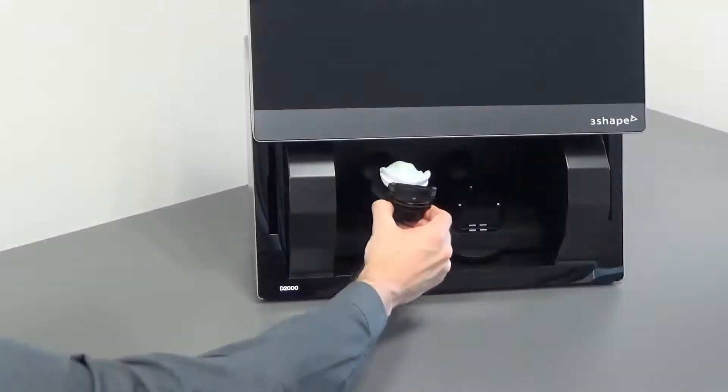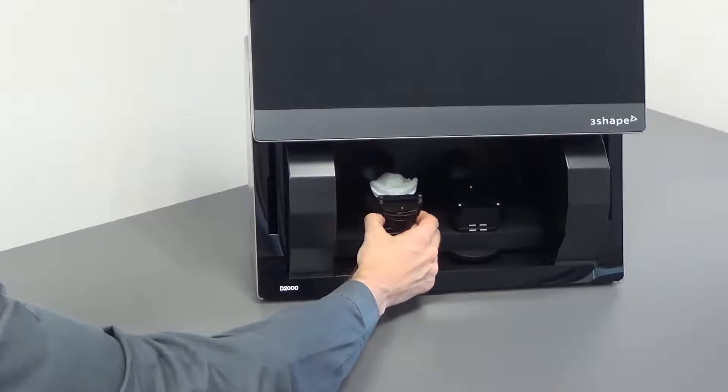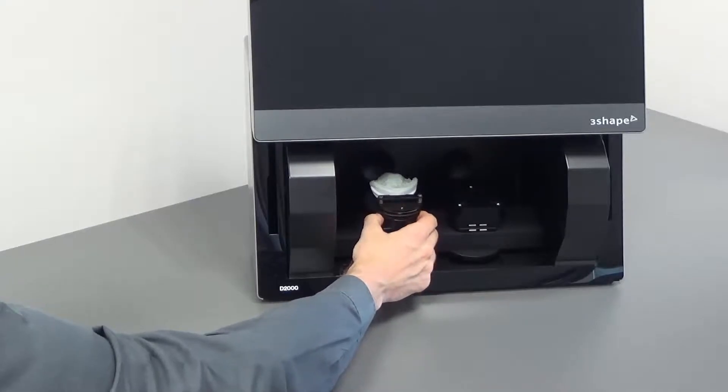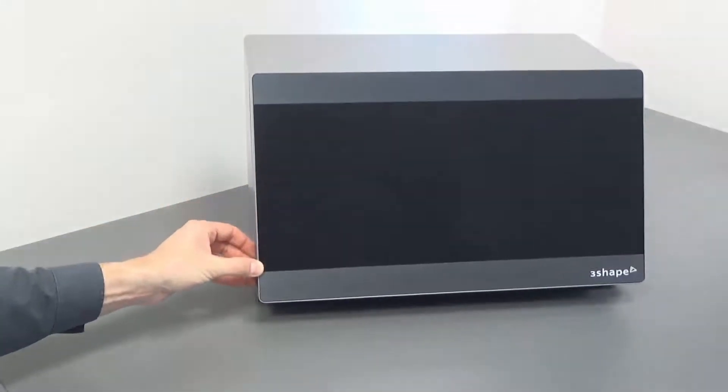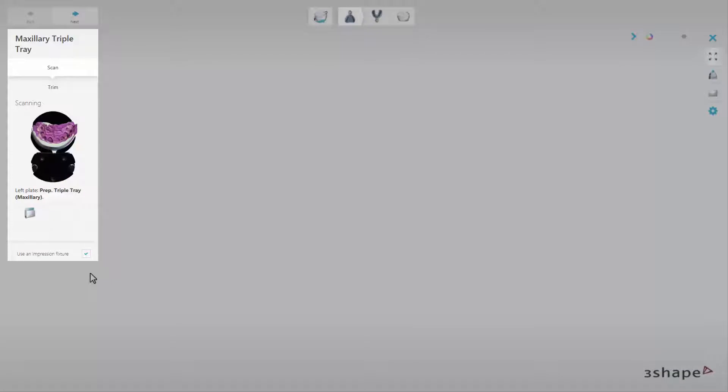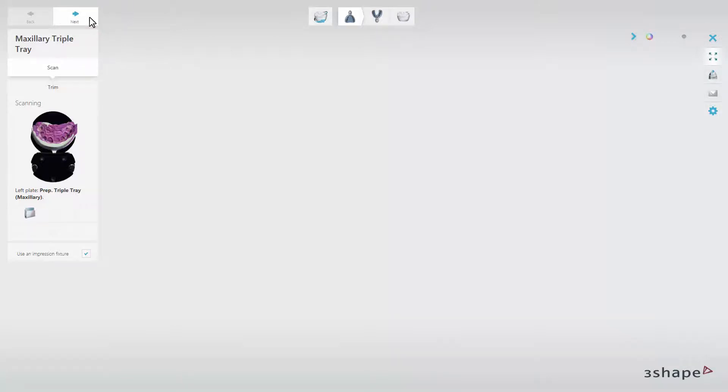If you use the D2000 scanner, insert the impression on the left side of the scanner. Always insert the impression in the way shown in the overview window. Once the impressions are in the scanner, click Next to start scanning.